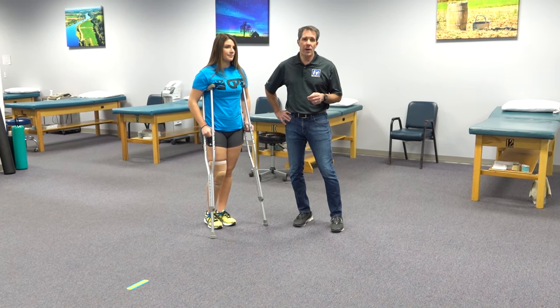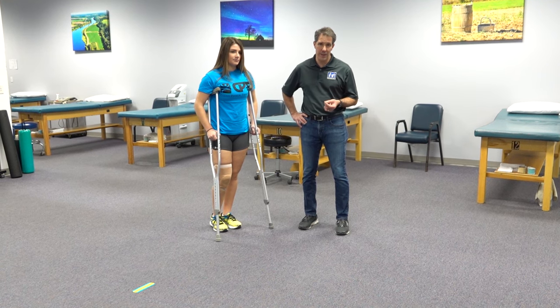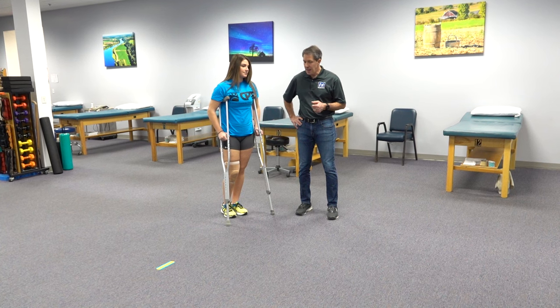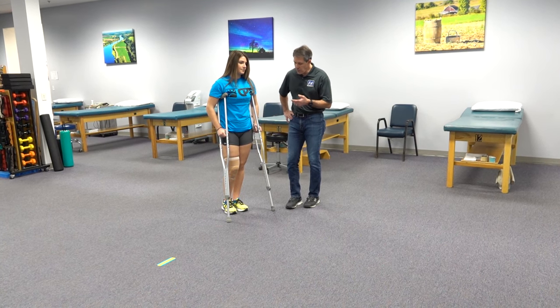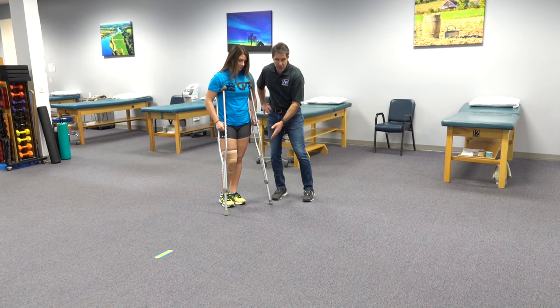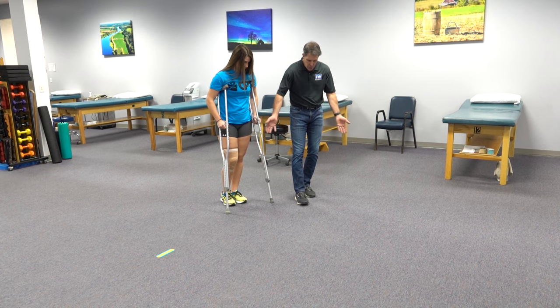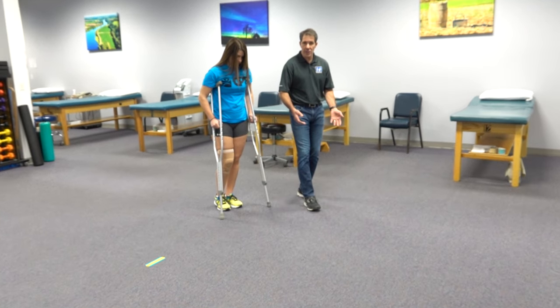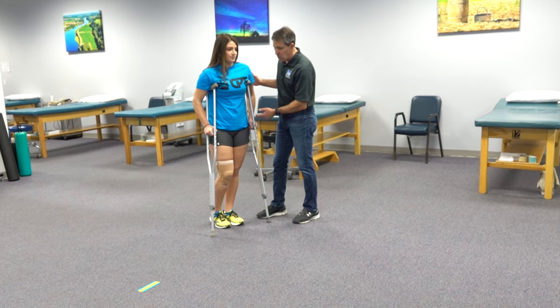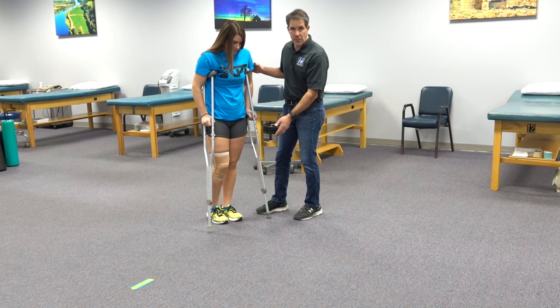Now we're going to talk about how to use your crutches if you're using a partial weight bearing or toe touch weight bearing gait, where we can put a little bit of pressure on the affected leg. It's important when you walk with your crutches and you're putting weight on that leg that the affected leg follows the crutches, almost like there's a rope tied from the crutches to that foot and they follow each other. The weight needs to be going through the hands, especially when the affected leg is touching the floor between the crutches.